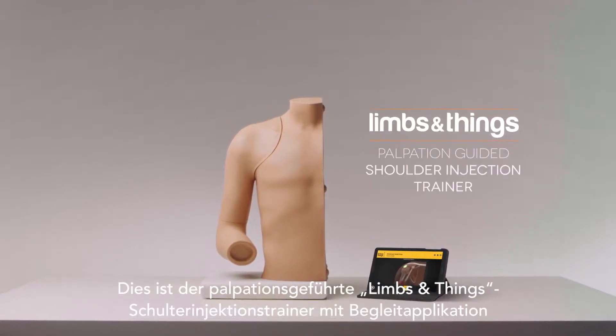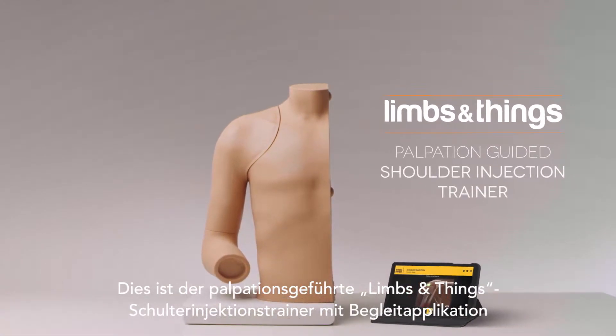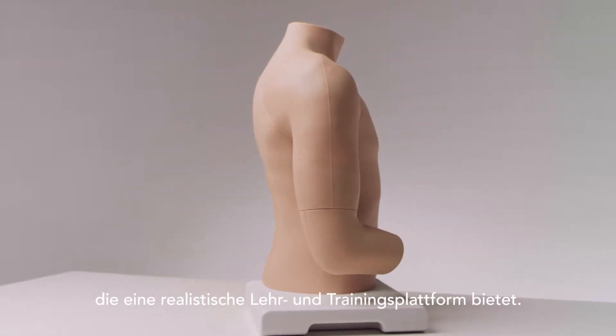This is the Limbs and Things Palpation-Guided Shoulder Injection Trainer with Companion App. It is an anatomically correct adult right shoulder that provides a realistic teaching and training platform.